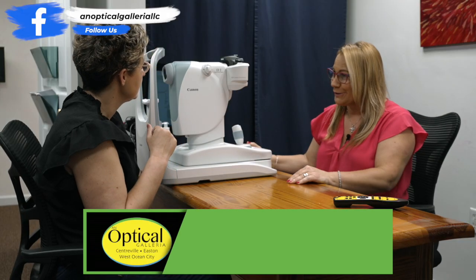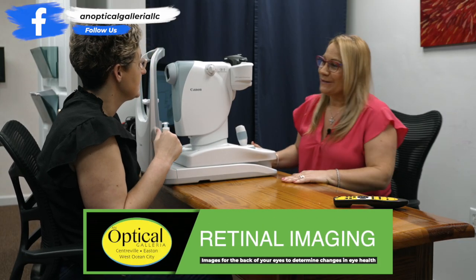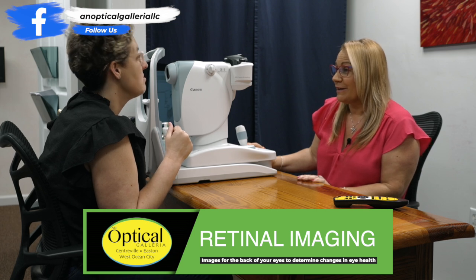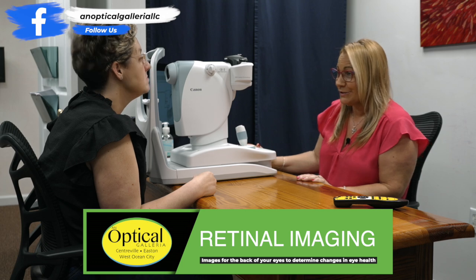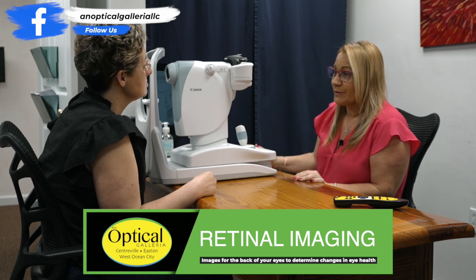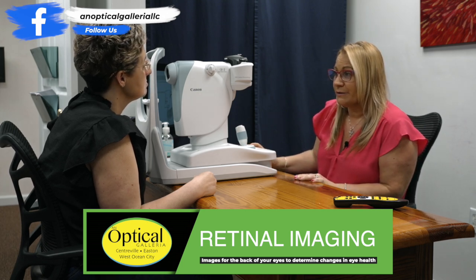This is a retinal photographer. This is doing retinal imaging of the back of the eye, the optic nerve, and the macula. It's a very useful tool because if you have any medical conditions in the eye we can send you to an ophthalmologist and they can treat and evaluate your medical conditions.